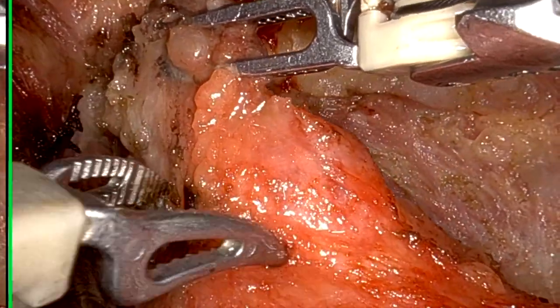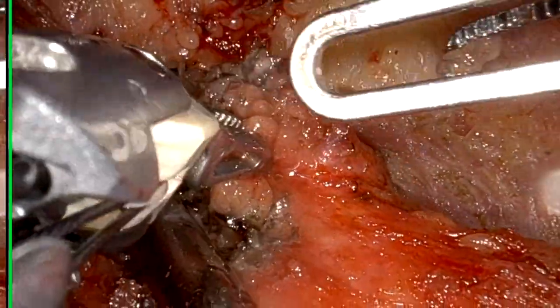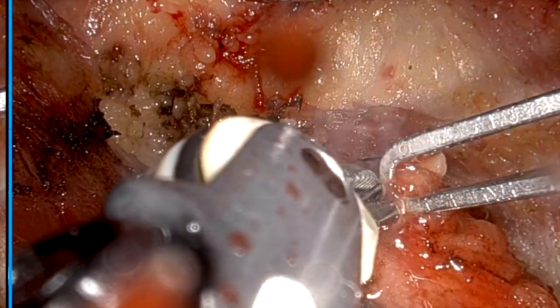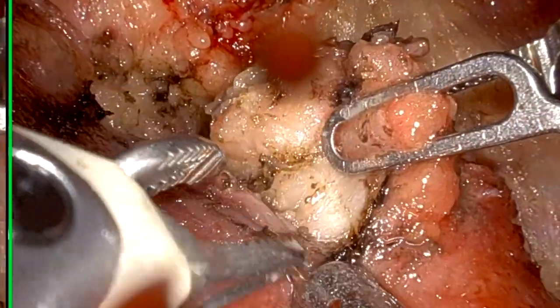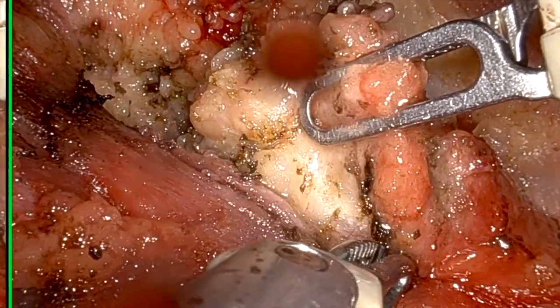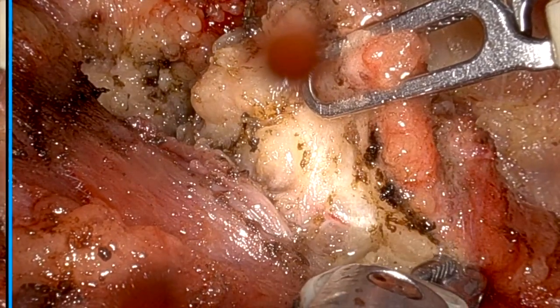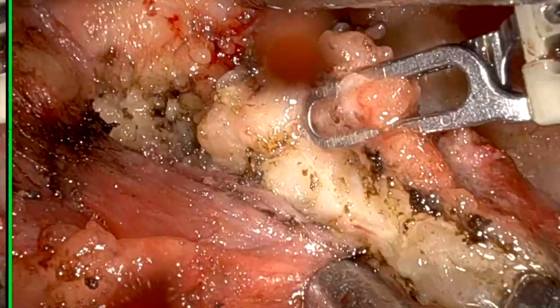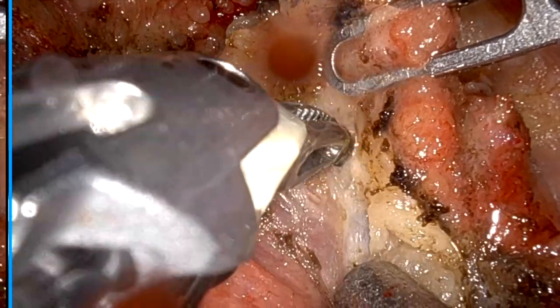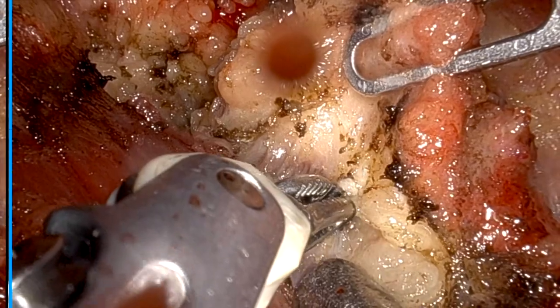The simple reason is we are going to do a free fibula in this case. Actually, this is a case of squamous cell carcinoma, right lower alveolus, and we are going to do segmental mandibulectomy. So the anterior cut we are going to take intraorally and the posterior cut we are going to take from this incision. Another thing, our microvascular surgeon will do microvascular anastomosis from the same incision, and our maxillofacial team will fix the fibula anteriorly from intraorally and posteriorly from this incision. So the patient has a single scar which he could hide.